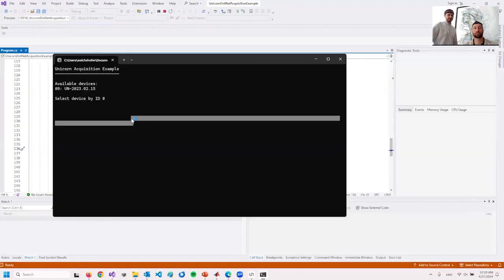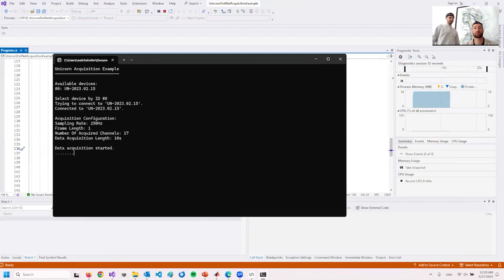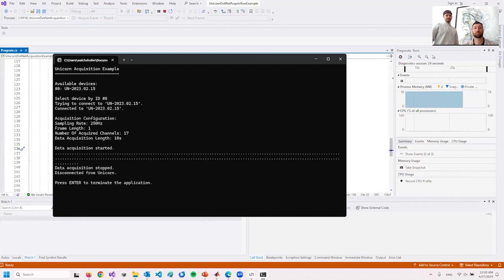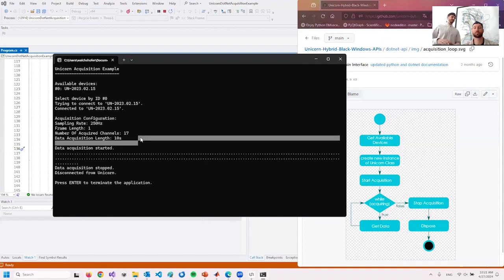Just to show you how that would look, we're checking for available devices, then connecting to the device. In the loop, we're measuring and receiving data all the time. After 10 seconds, as we've said, the data acquisition is stopped again and we're disconnected from the Unicorn. So exactly as in the image: get available devices, open device, start acquisition, looping, stopping, and closing the device. That's the basic strategy for all BCI systems if you want to get raw data in a data acquisition system. No matter if you're using the C API, the Python API, or the C# API, they all follow the same strategy.